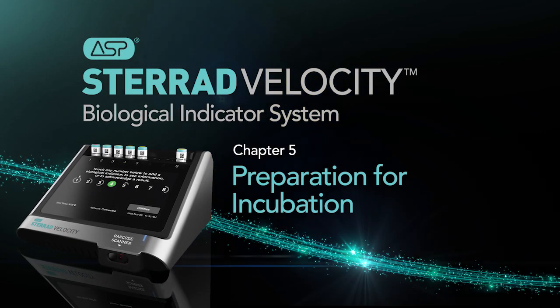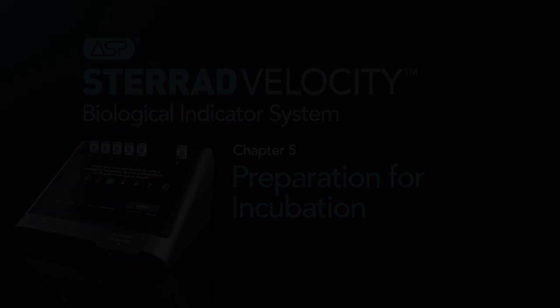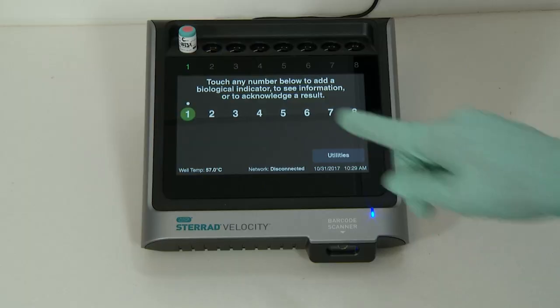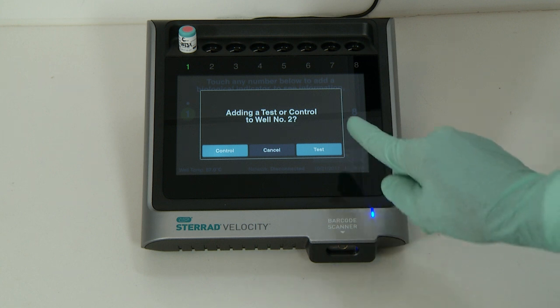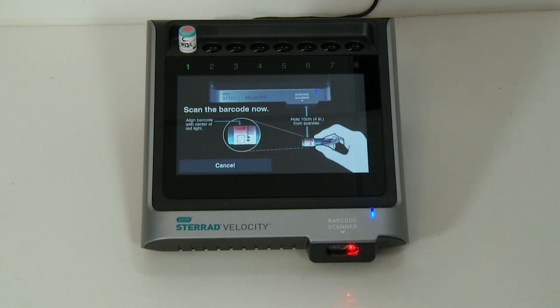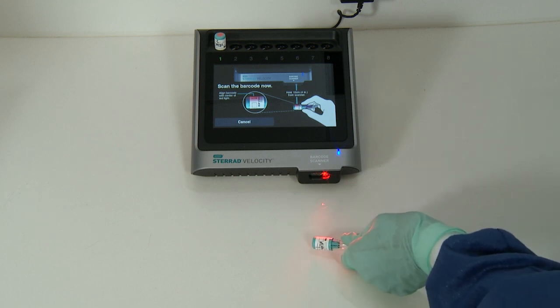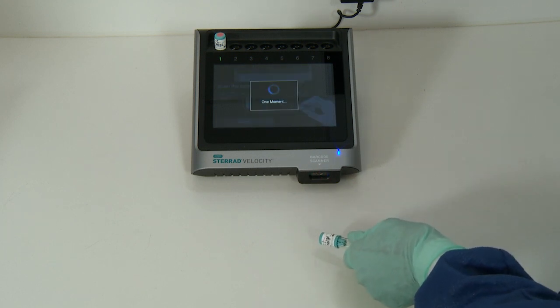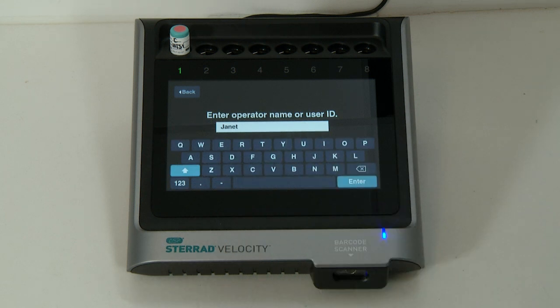Let's review the instructions for operation of the reader and incubation of a process test biological indicator. To begin, touch an available well indicator number on the reader's touch screen. The selected well will then be used for reading. Next, touch Test to add a process test biological indicator to the well. Before placing the BI in the well, first scan the barcode on the cap label using the barcode scanner on the front of the reader. For best results, position the BI four inches in front of the barcode scanner during scanning. Enter the operator's name in the space provided, or select the operator's name from the list.